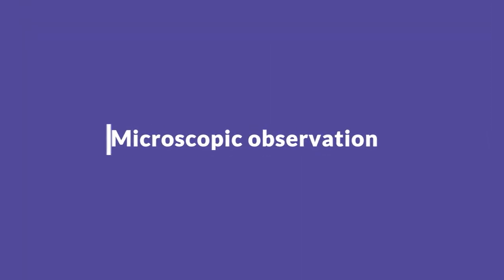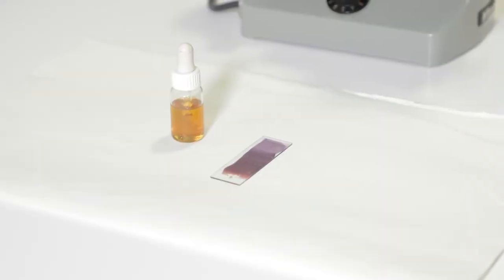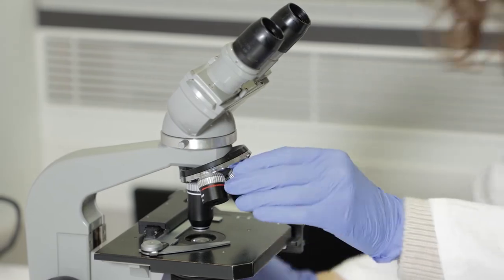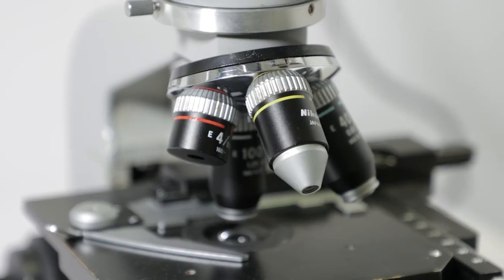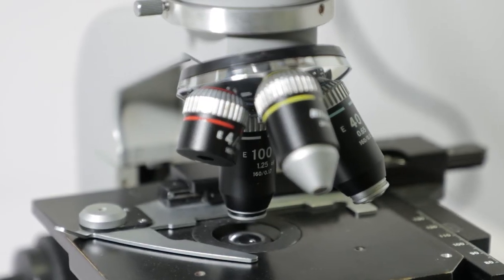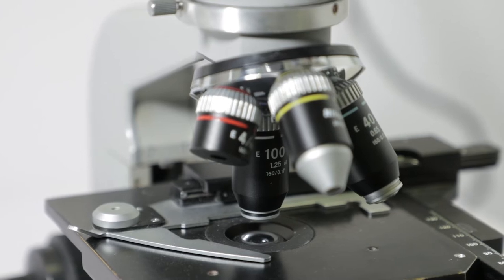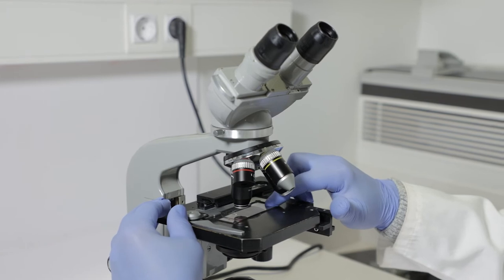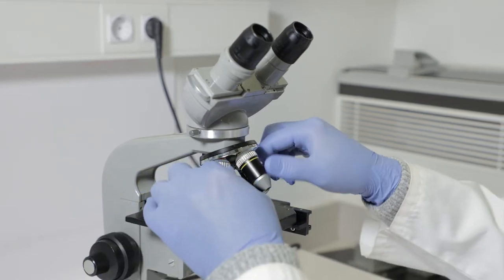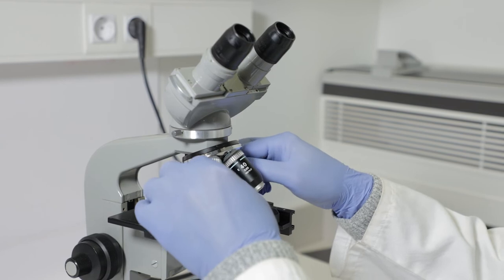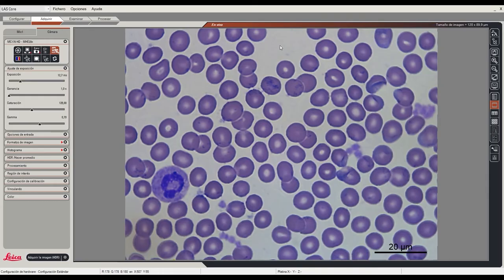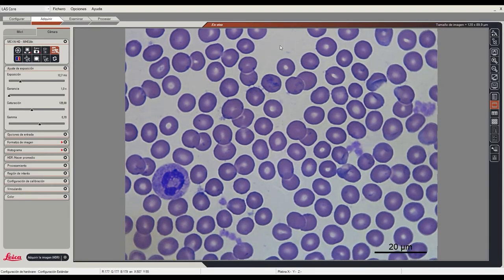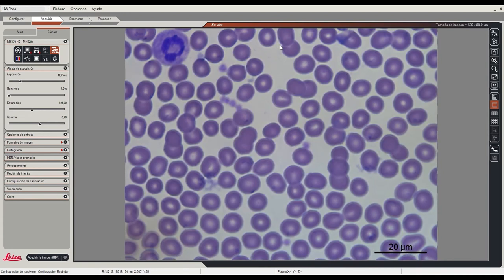Microscopic observation. After staining and air drying the sample, it is examined under the microscope with 4x, 10x, 20x, and 40x magnification objectives to see the distribution of the leukocytes. Since the distribution is often very uneven, as many leukocytes are mainly found at the edges of the smear, the study should be carried out over the entire width of the slide.